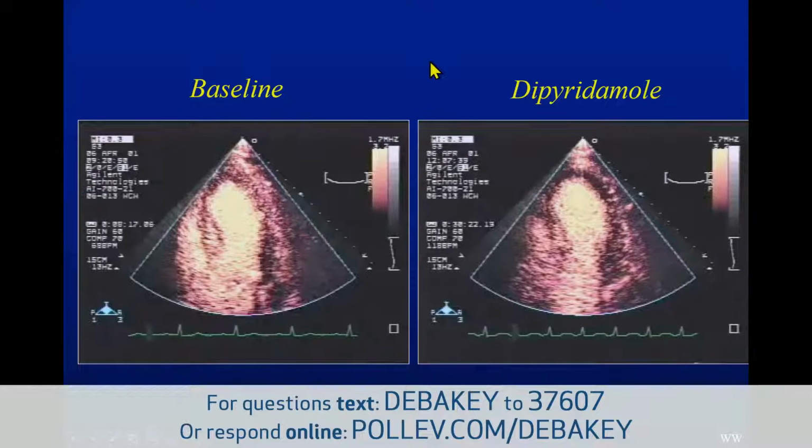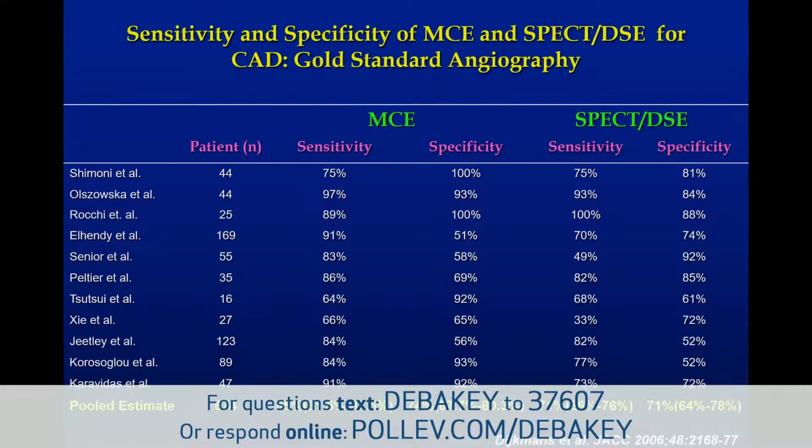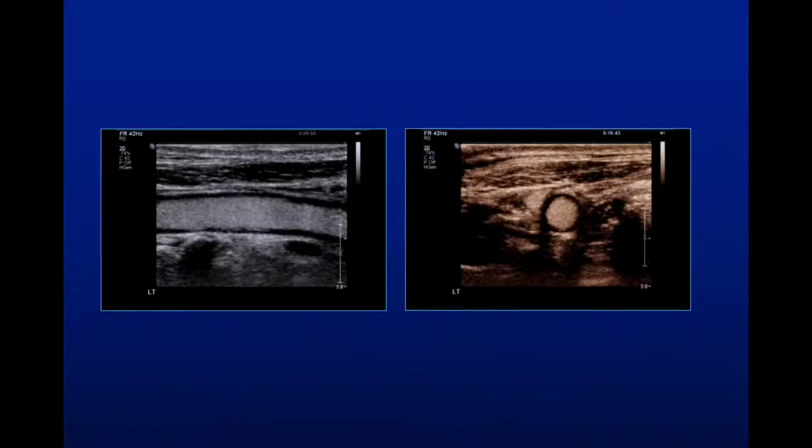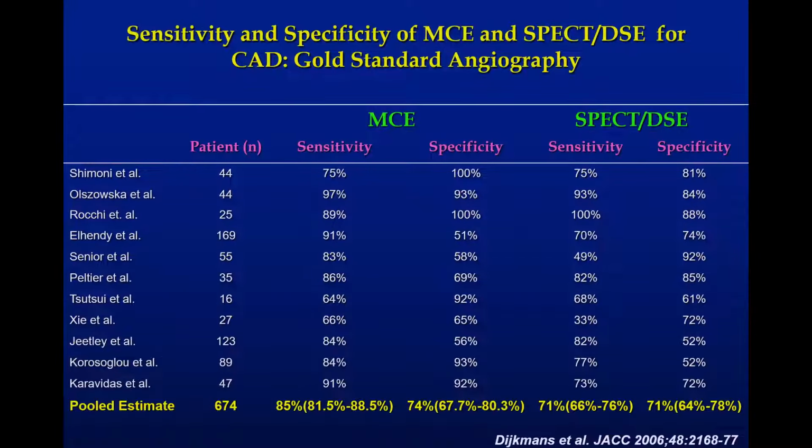We're not actively involved at this stage of the game in researching myocardial blood flow using contrast, but you could see there Dr. Sarah Shimoni, who was with us, and many other investigators looking at sensitivity and specificity. But we have to be cognizant that indeed the field of myocardial perfusion is very competitive.